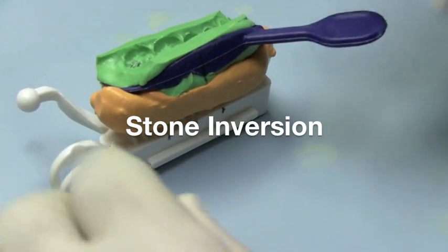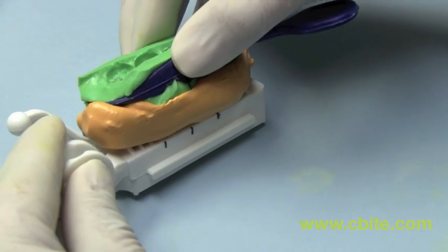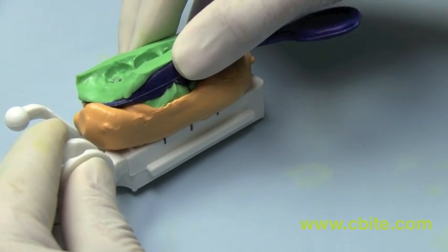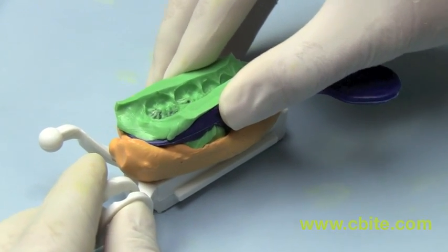When inverting the stone to the articulator, slowly roll the stone from back to front and hand vibrate at the same time. This will minimize air pockets that are caught between the articulator surface and the stone.